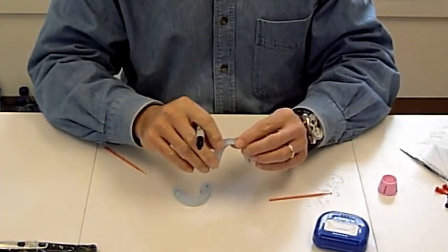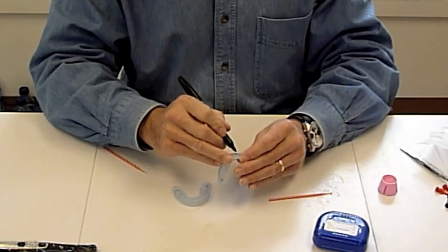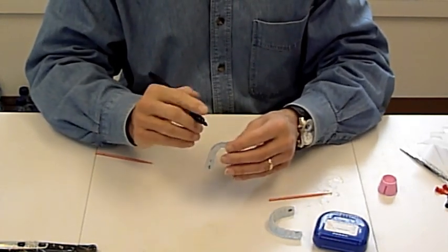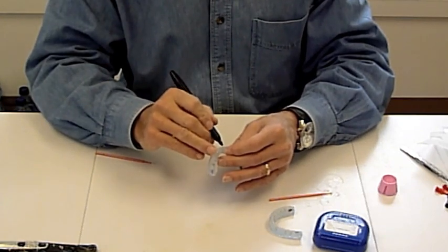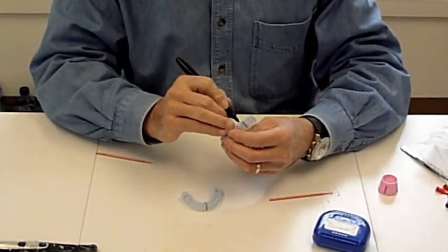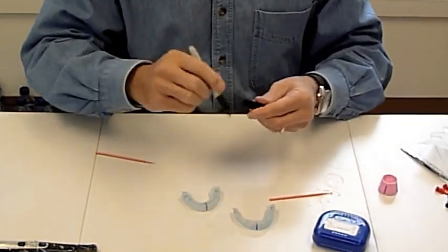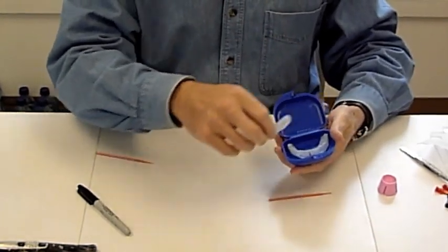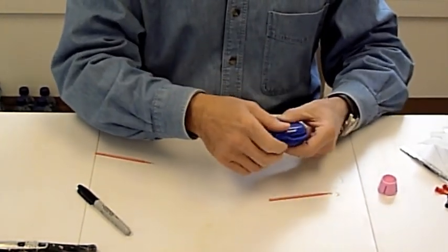We're going to mark the midlines of each tray so that it makes it much simpler for us to seat the tray in the mouth correctly. We've got our midlines marked, and then we're going to take our trays.